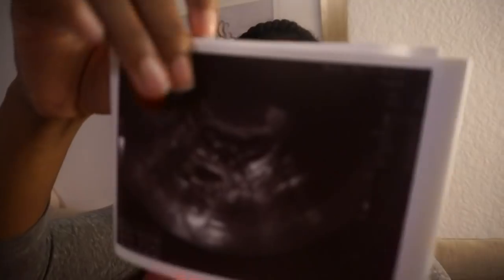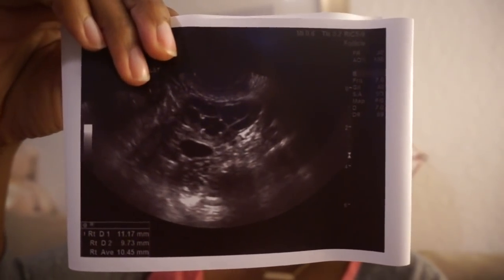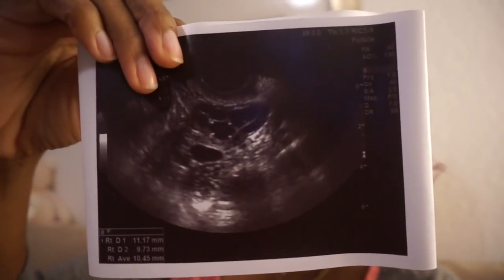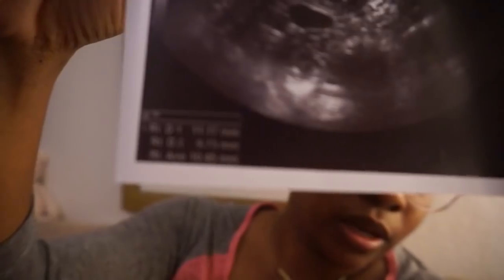At first she was like, oh, I see the right side. It looks like you got a lot of them trying to mature, but nothing really seems mature yet. So I was like, oh my God, here we go. I didn't respond to letrozole or whatever. I've been so worried all weekend that I wasn't going to respond to it. Here is what my right side looked like. I had a whole bunch of follicles trying to mature, and the largest one was at a 10. You can see the numbers down in the corner.